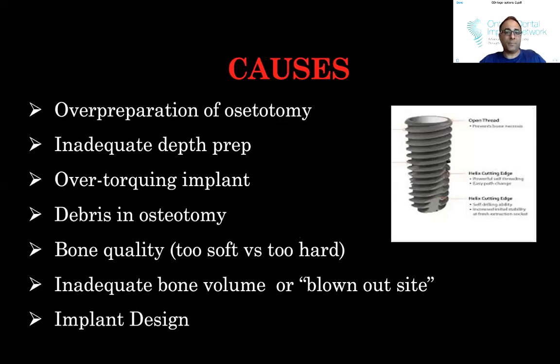And this commonly happens with guided surgery because your guide is not seated and then you're gun shy and it won't go right down. Over torquing the implant. So you're just torquing and all of a sudden it just gets loose, okay? Because you're trying to push it in more when you haven't prepped the depth properly. What if there's debris in the osteotomy? So cortical bone, and now all of a sudden there's debris in the osteotomy. And again, that's impeding your implant from being placed.